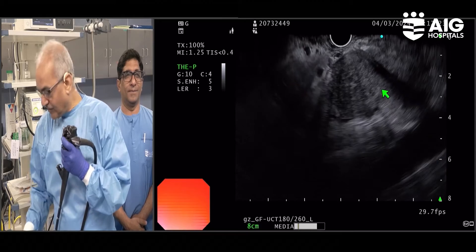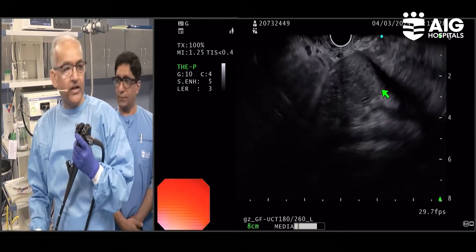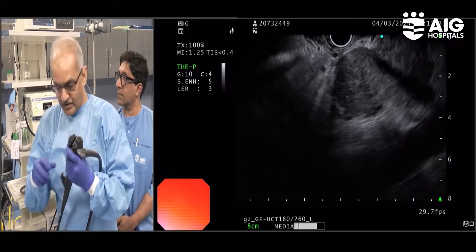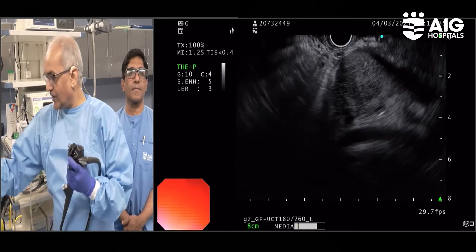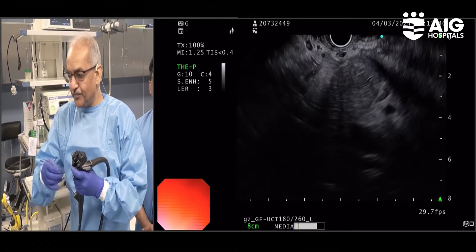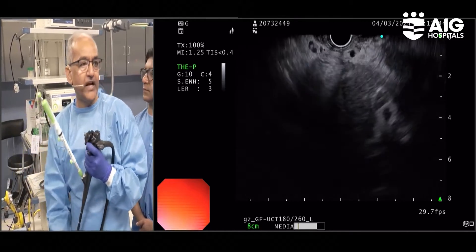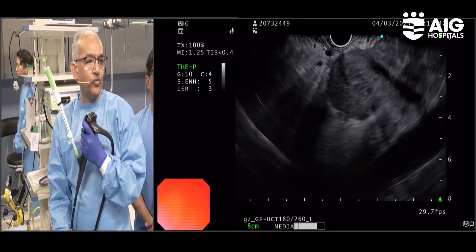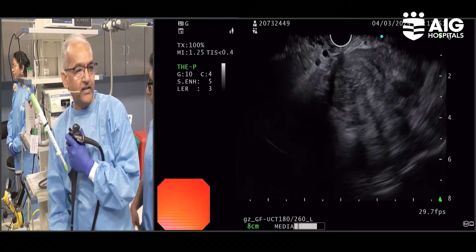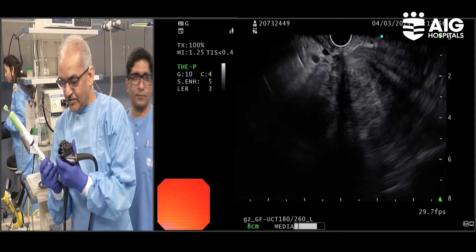This is the mass which will be sampled. Instead of ROSE, we will use VivaScope and ask Dr. Anuradha and Dr. Babak to tell us what the likely histology is going to be. I am using a 22-gauge core needle to get the tissue, which will then be subjected to post-acquisition analysis using VivaScope. Mohan, who is an expert EUS operator himself, is with me.